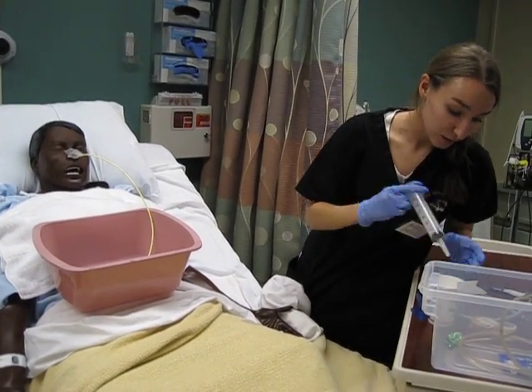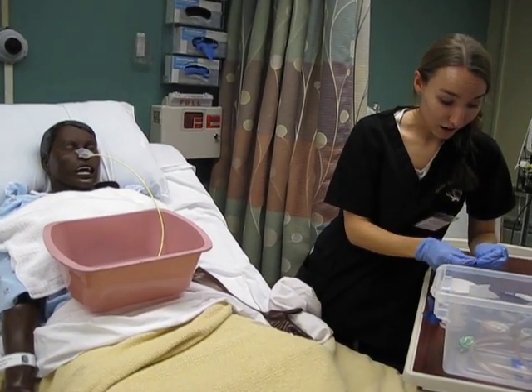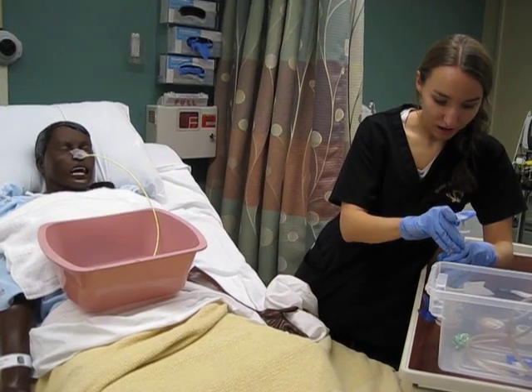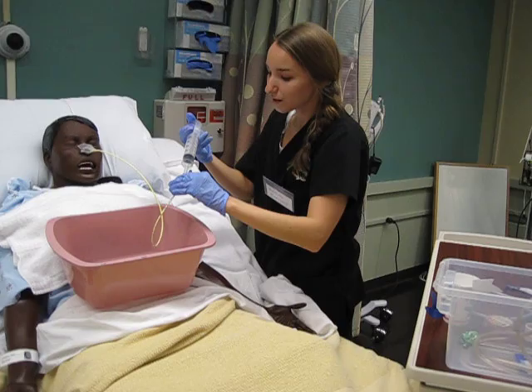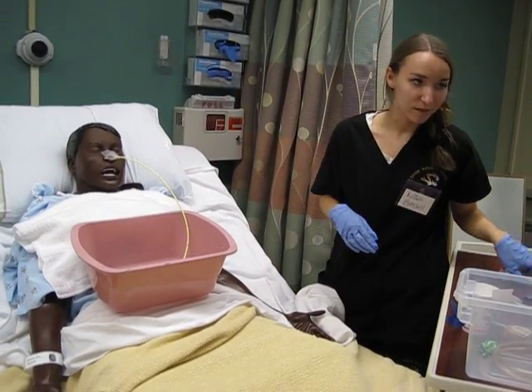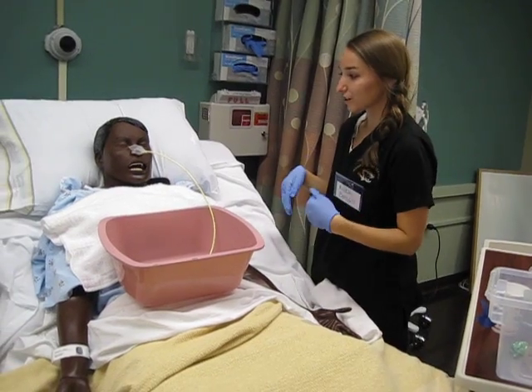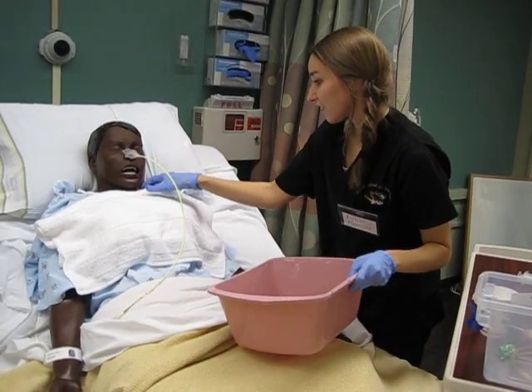It's a green color, which is really good, and I'm just going to check the pH — it's a 1, and that's also normal for your stomach. And then I'm going to put it back in really quick. The last thing we're going to do before we can start feeding you is take an x-ray just to make sure it's in the right placement. Do you have any other questions or need anything else?